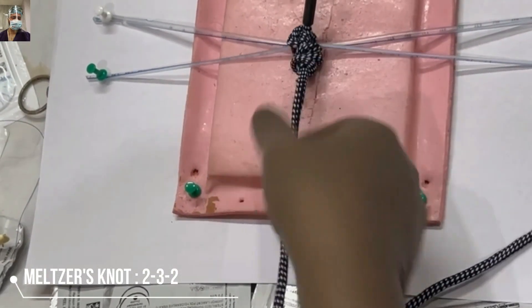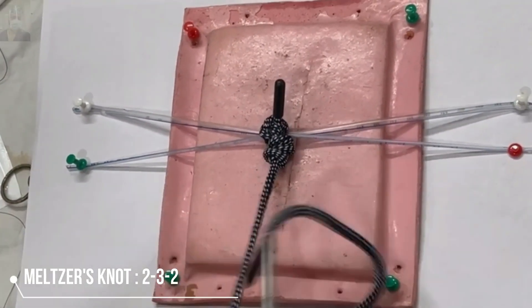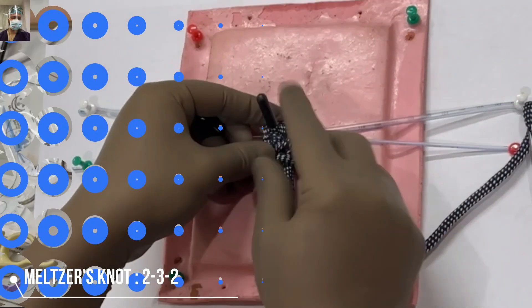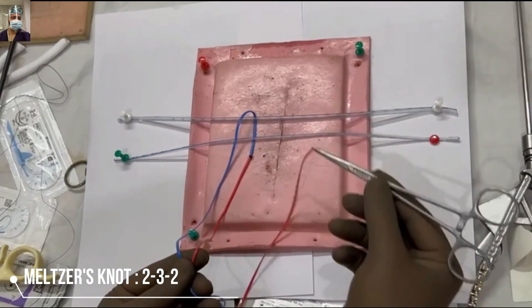Stack the knots and binds properly, and then you can start sliding. It will hold quite good strength and won't slip back. This is one of my favorite knots while doing extracorporeal knotting, and it gives added security as a 2-3-2 knot.